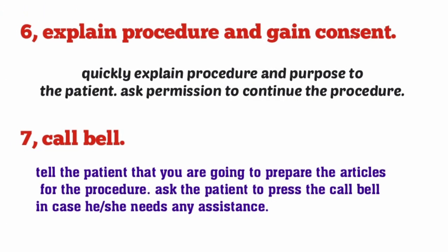Then quickly explain the procedure and purpose to the patient and ask permission to continue the procedure. After that, give call bell education to the patient and go to prepare your articles.